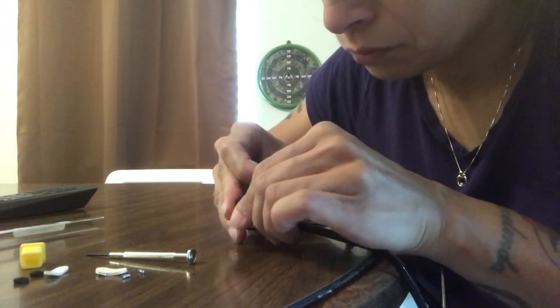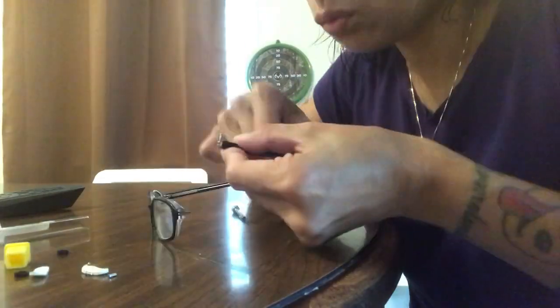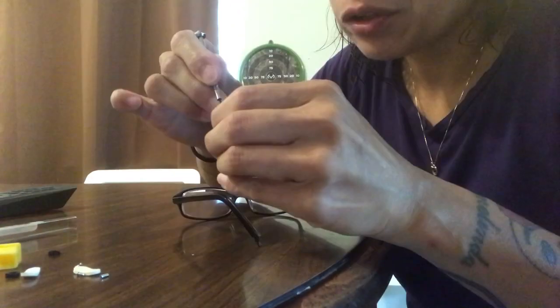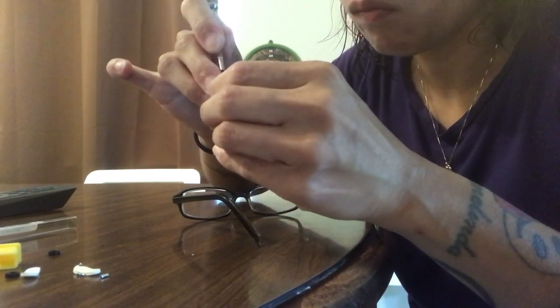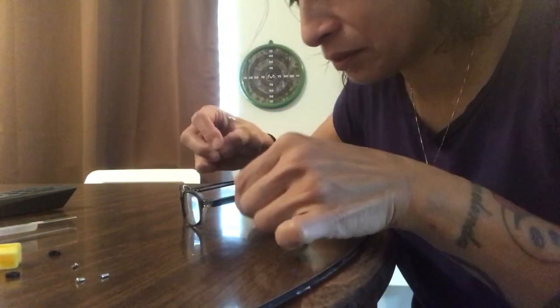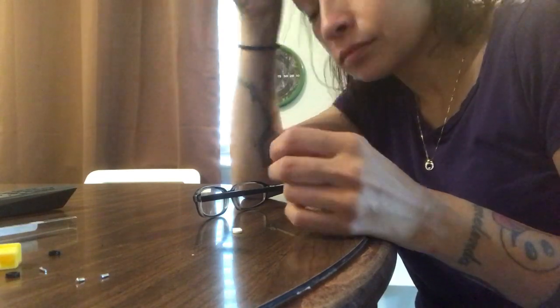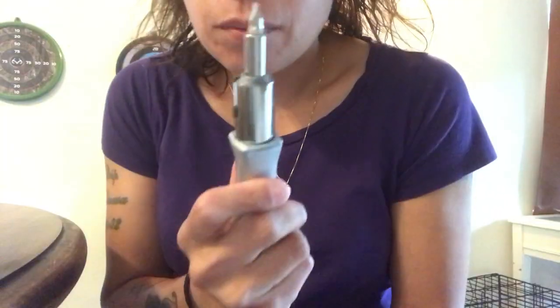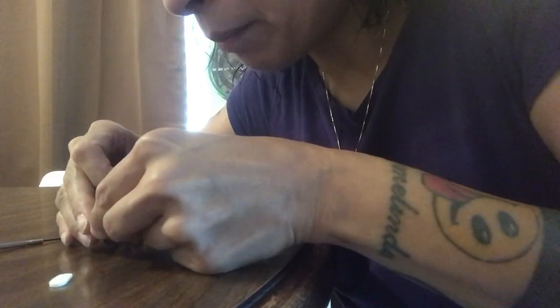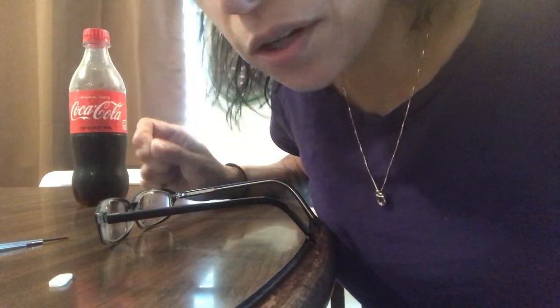I don't know if it looks easy but it's definitely not. It feels like when you're trying to put a thread into a needle. I need to meditate. I'm gonna try a bigger one. I had my Coke, I'm ready to take on this challenge.